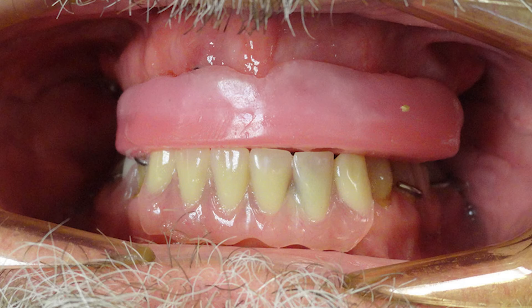After passivity is confirmed, seat the bite block and hand tighten screws. Use conventional denture techniques to capture jaw relation records. Then choose a Vita shade for tooth color and a gingiva shade.